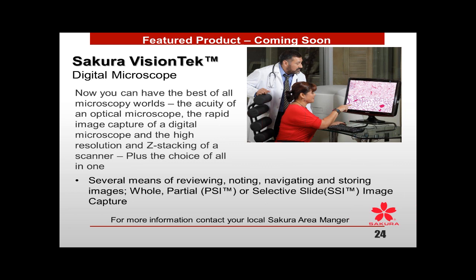Well, that will really be dependent upon the system you purchase and their software, what I'll call the digital scanning software. How they're able to annotate, select, capture, create new images, and integrate that into the patient report.